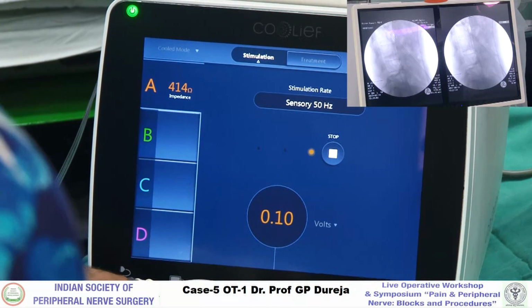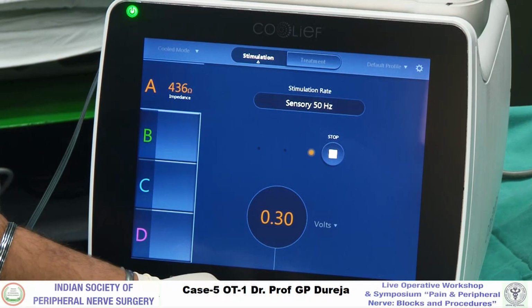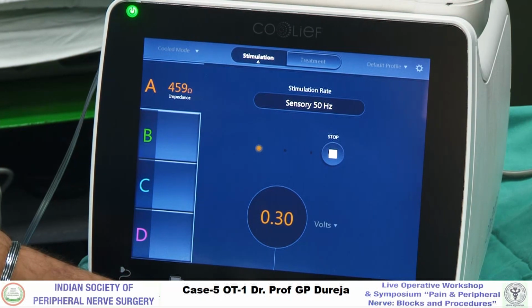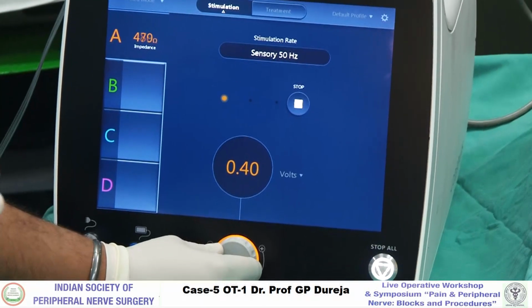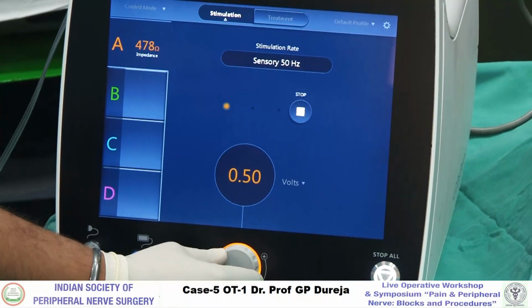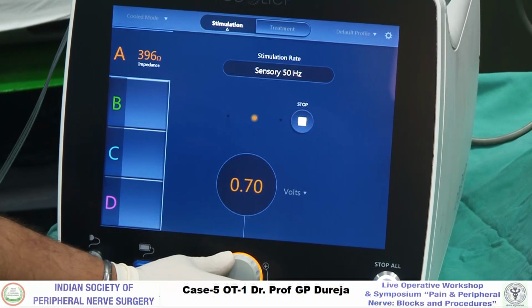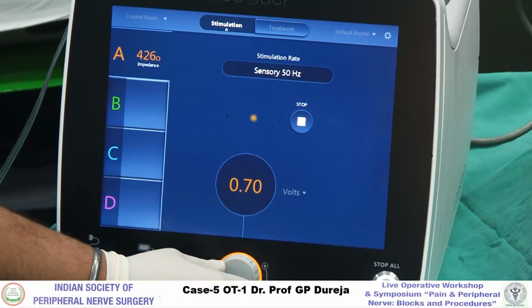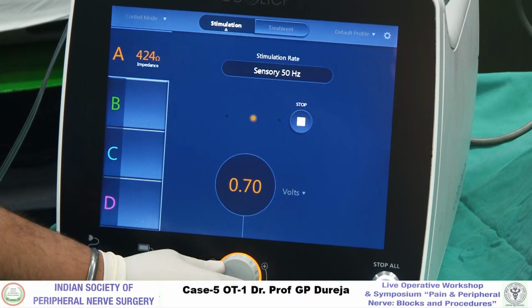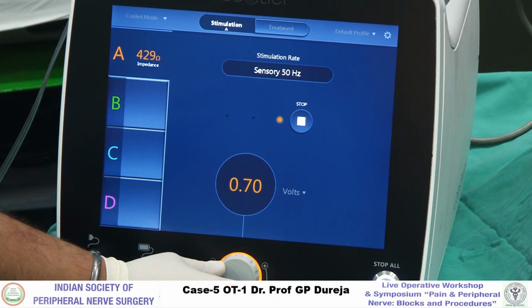धीरे धीरे. आप कैमरा है इधर, कैमरा है इधर. हाँ sir, we can see. हाँ जी. 0.4. पैर में तो नहीं जा रहा जी. बिल्कुल नहीं. और डालिए. और जाइए. कहीं पैर में कहीं लोकल आ रहा है वहाँ पे. ठीक है जी. और बढ़ाओ. हाँ, आप कहाँ पे आ रहा है? पीठ में आ रहा है ना, पैरों में तो नहीं जा रहा. कमर में ही है ना, इनके पैर में नहीं जा रहा. अच्छा, कह रहे हैं कि पीठ में ही है पर पैर में ज़्यादा तो नहीं फील हो रहा. ठीक.